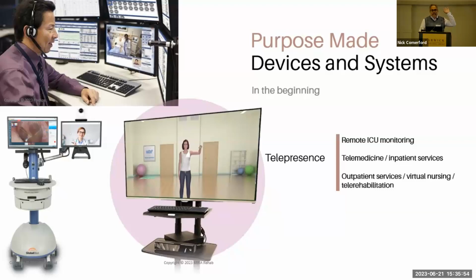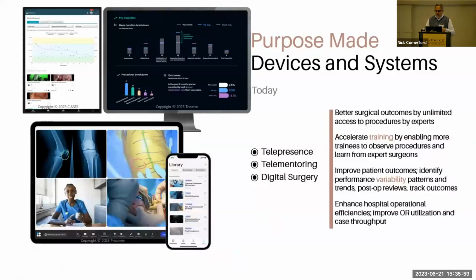So I'll look at the beginning, 10, 20 years ago, and a little bit of where we are today. Lower left is Proximie, the company I used to work for. They make a software platform for teleproctoring and telementoring in the OR. Basically, you stream audio, video, and annotations, unlimited. Remote doctors can join in and help proctor a live surgery.